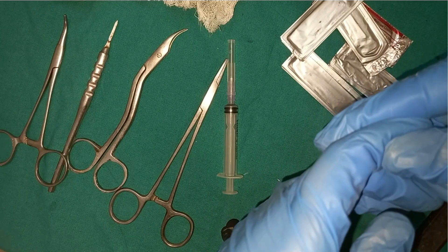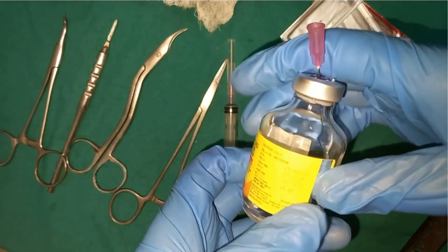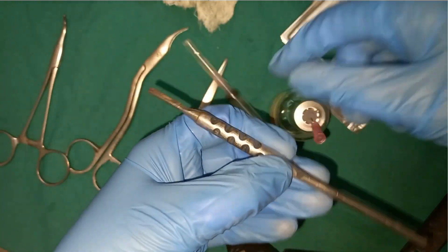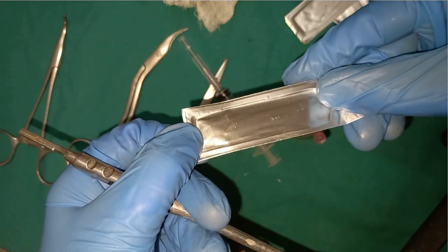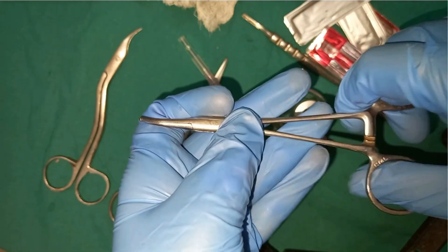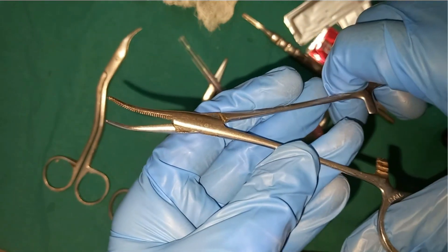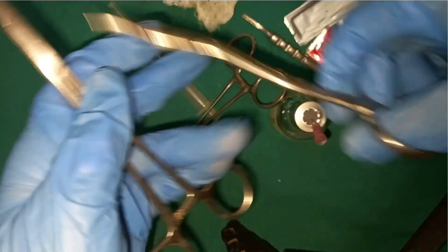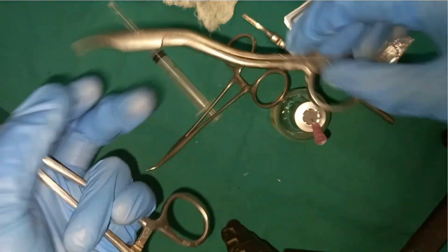Now, what armamentarium do we require to perform frenectomy? We require local anesthesia and a syringe so we can anesthetize the area for a painless surgery. Then a scalpel with blade number 15 to excise the connective tissue. Next, a hemostat or artery forceps so we can hold the frenum and easily excise the part.